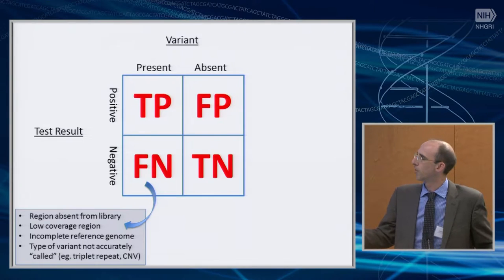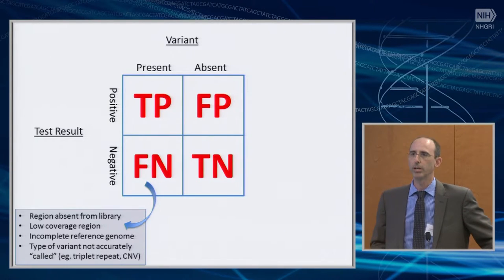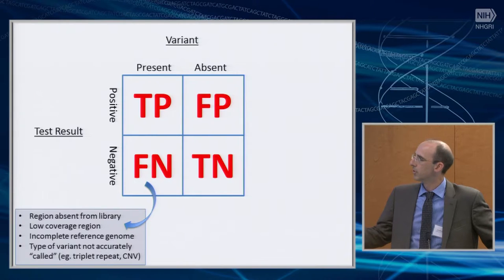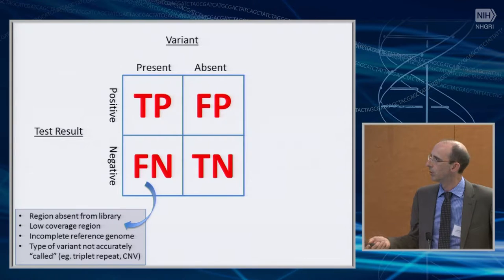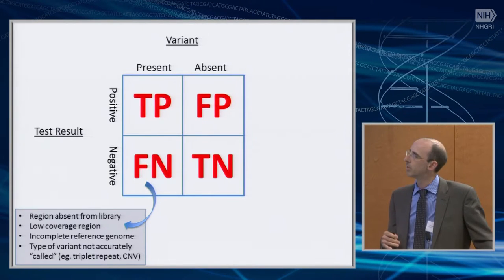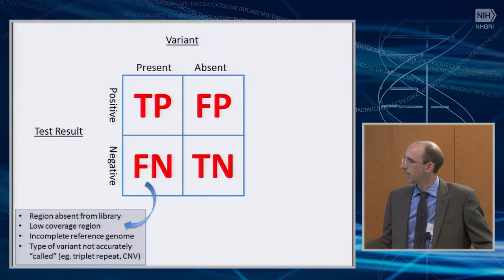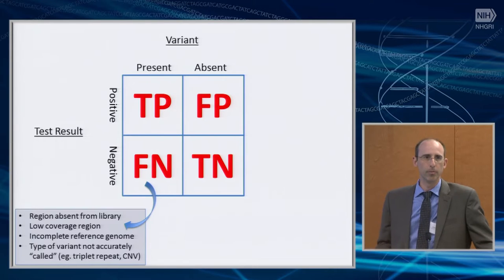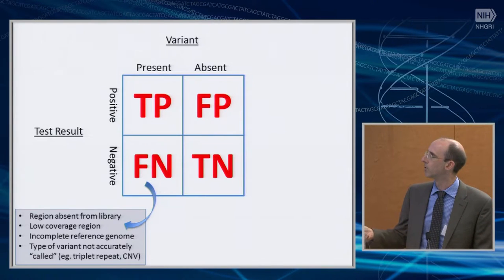So a few things that could cause a false negative. So you might have a library preparation, like an exome, that doesn't amplify a particular region, right? And that region happens to be where that variant is present, so you're going to have a false negative because you didn't cover that region. That may be a little bit less of a trouble with a whole genome sequencing, but there still may be regions that don't get sequenced very well, a low coverage region, for example. The reference genome itself may have some incompleteness such that reads are getting mapped in different places, and there may be a clinically relevant variant in a part of the genome that hasn't been finished, and so therefore your variant calling isn't going to accurately reflect that. Or there may be even certain types of variants like triplet repeats or copy number variation that really doesn't get called very well with your particular pipeline. And so those are all the sort of possible false negatives.